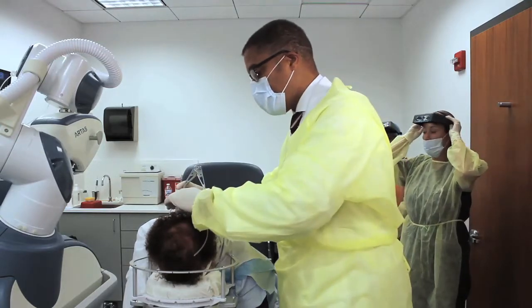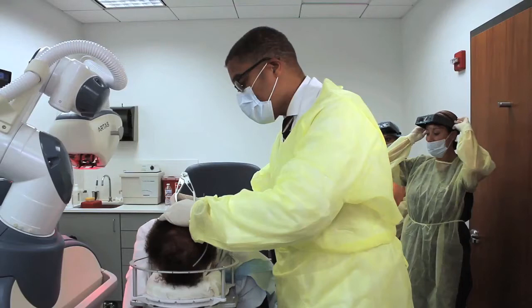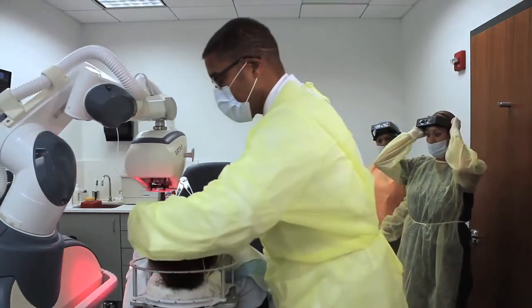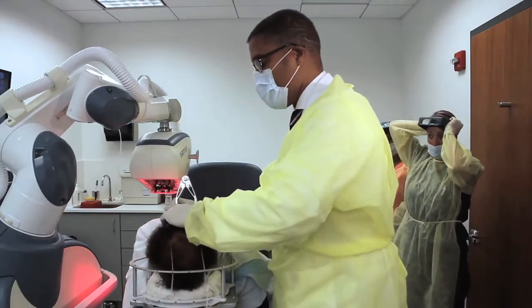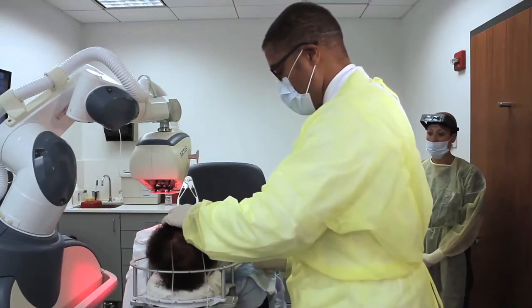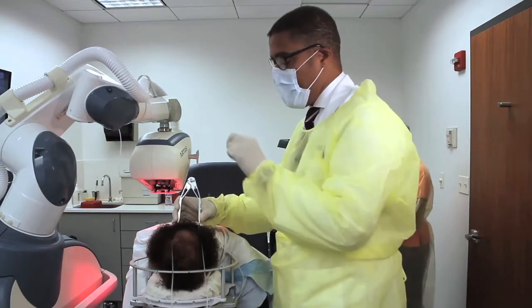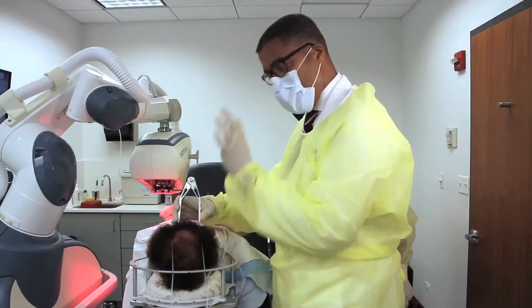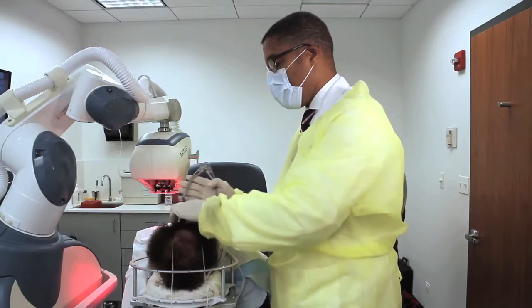Fancy stuff here in Chicago — best city in the world. The Bears first game is tonight. So we kind of lock this on, and this puts tension on the skin, so when the punch engages the scalp the skin doesn't move, so it's a straight punch with the hair right in the center, and we get an excellent graft.